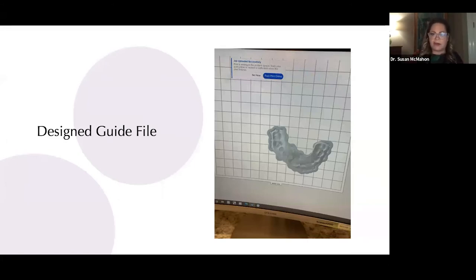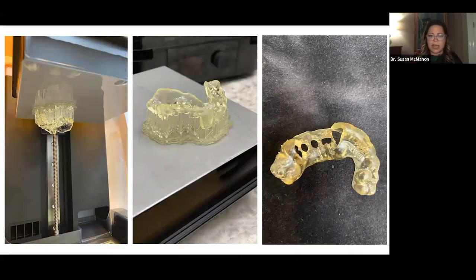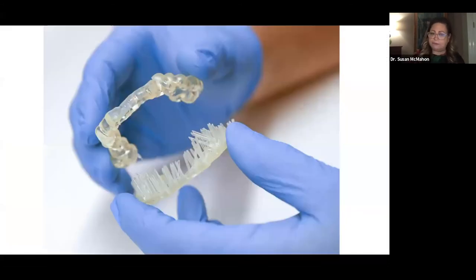So they send back a file for us. And then we load that file right up into our Preform, which is, you know, the software that helps us design these anchors or design these supports. We load it up onto that. And then we just print it. So there's the guide being printed in the office. On the left side, it's on my platform. Then it's taken off. We just pop it off, cut those little supports off. We put it through a wash and then it gets through a cure. And then we have a product there, breaking it right off the supports.